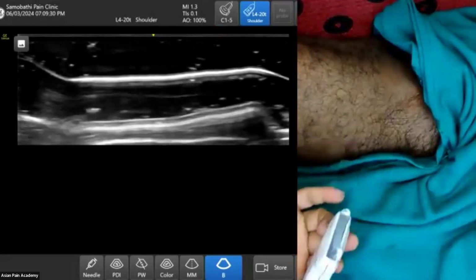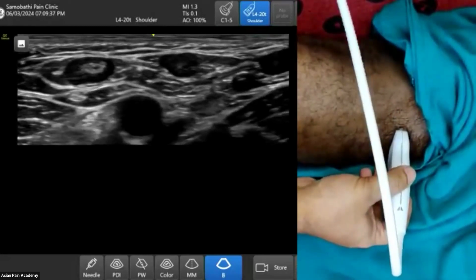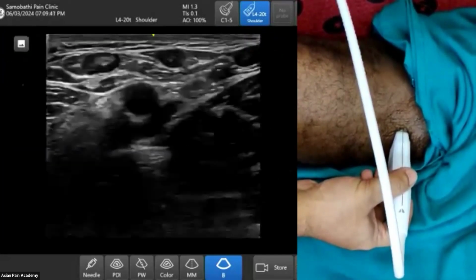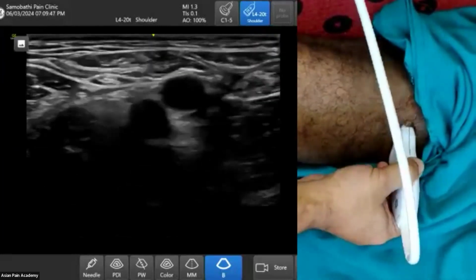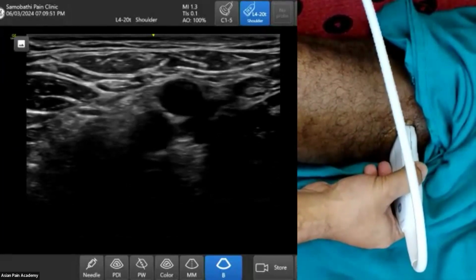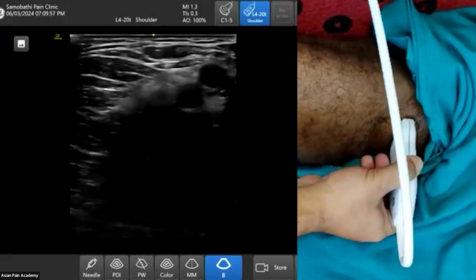So where are the obturator nerves? Simply, I understood that I have seen these vascular areas. These are over the femoral triangle, I mean the iliacus area.